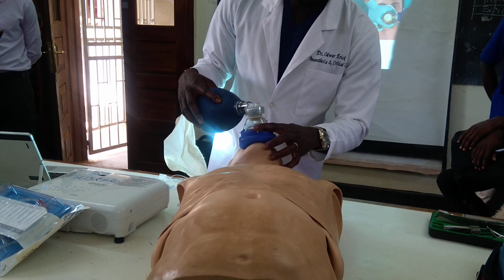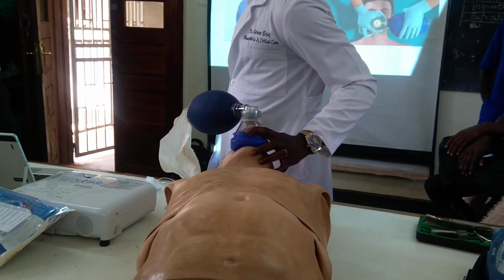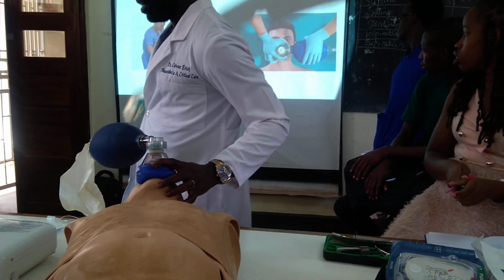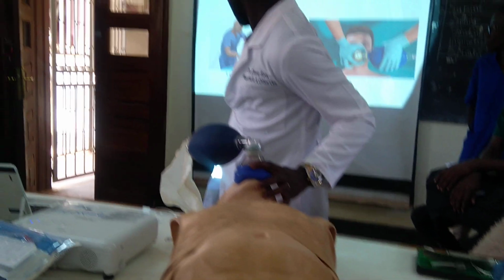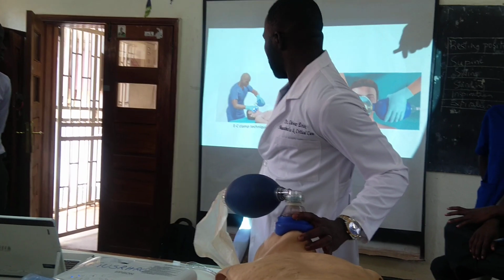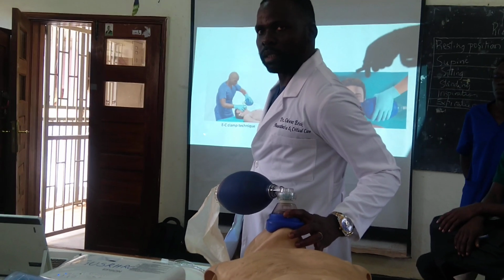Dear bony prominence. This is the E clamp, CE. Have you seen on this, the CE clamp? The C is on top: the thumb, the other side, and this index finger. Then the E are these three on the bony prominence.